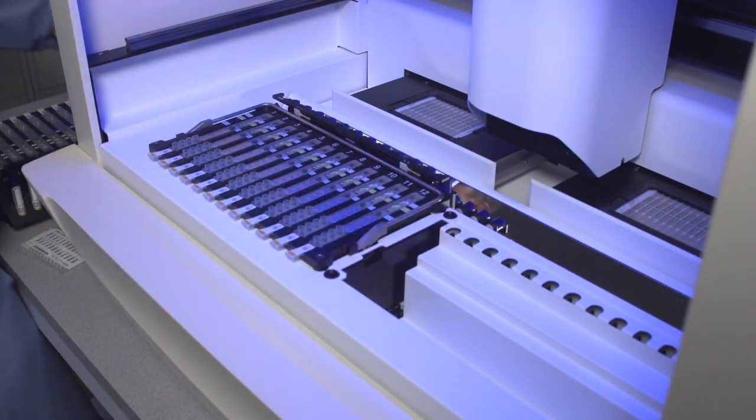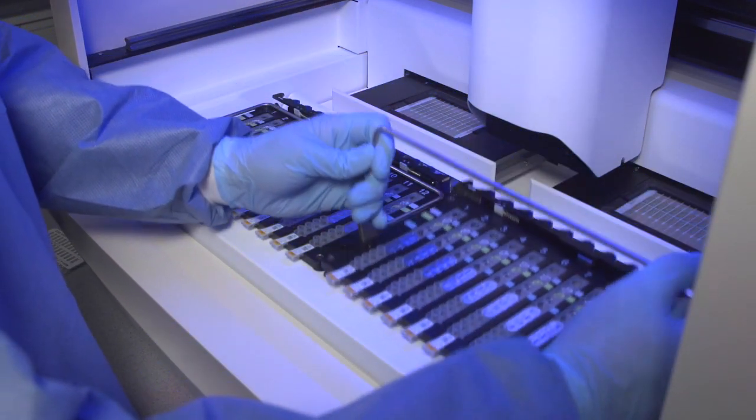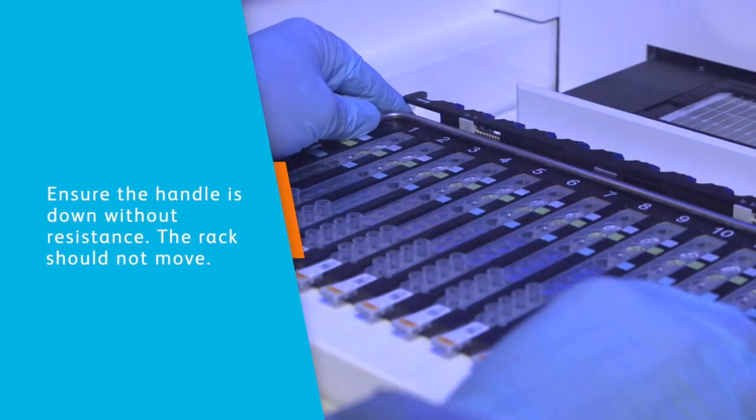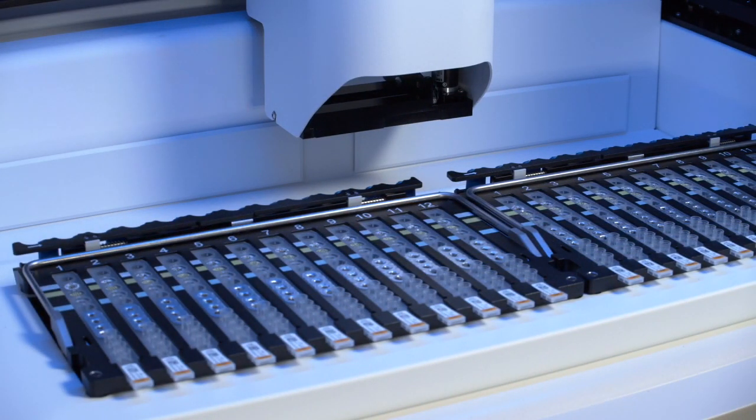Place the sample rack or racks into the system. When the rack is in position, lower the handle to lock it in place. You'll know your sample rack is seated properly if you can put your handle down without resistance and the rack doesn't wobble. Your tubes will face opposite you. Repeat the procedure for the second sample rack.